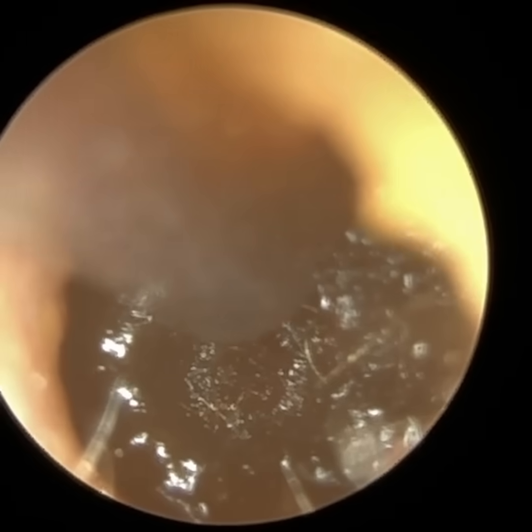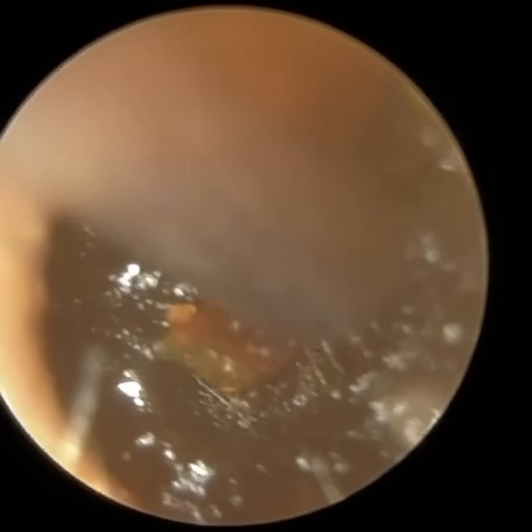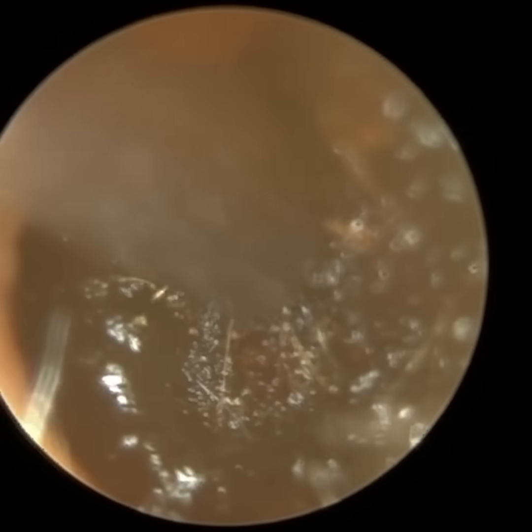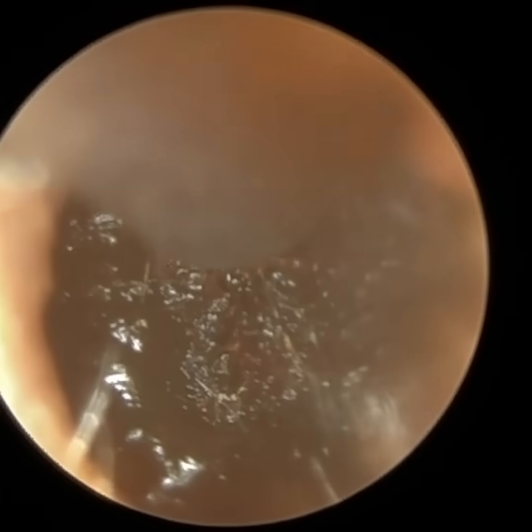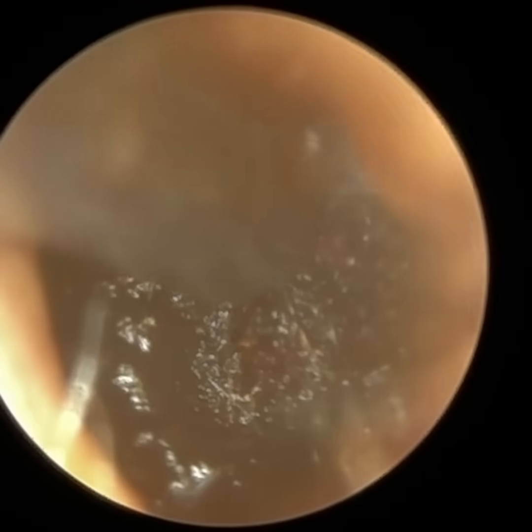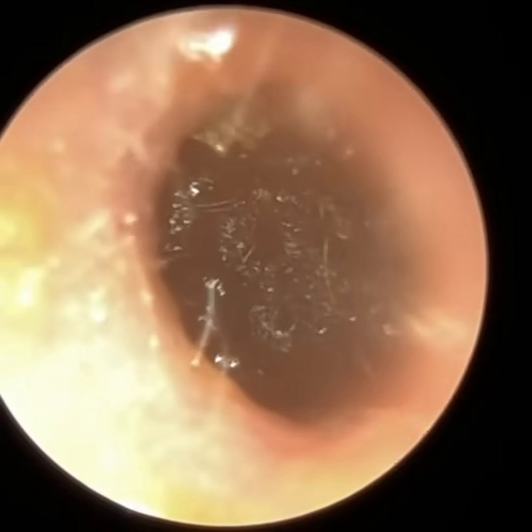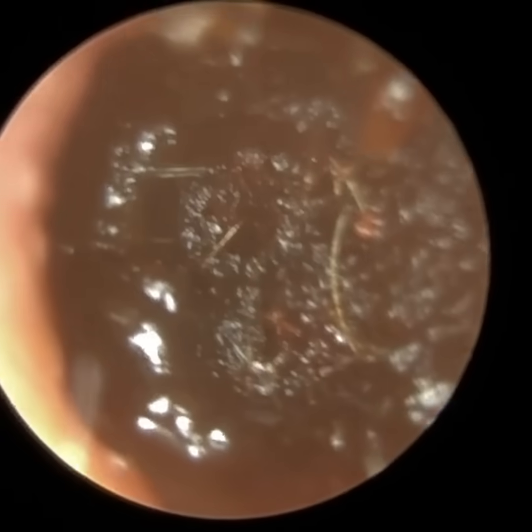Now, when you've got a narrow ear canal like this, you're more prone to having a wax impaction, so that might be a secondary cause as a result of their stenotic ear canal. But if you watch right till the end of the video, you'll see an abnormal looking eardrum. So I feel it's not an outer ear issue, it's more of a middle ear issue causing a conductive loss where the sound can't travel through the ear canal or the eardrum before it reaches the organ of hearing.